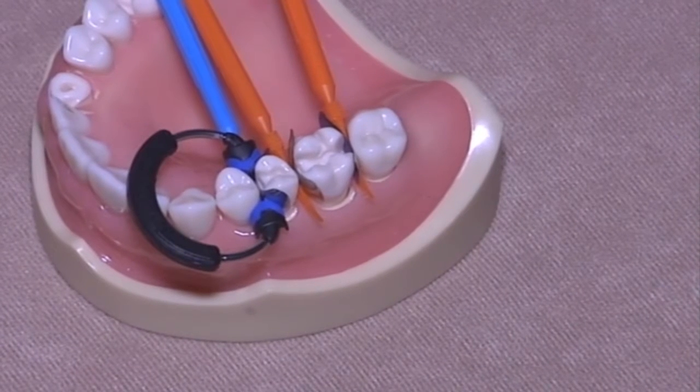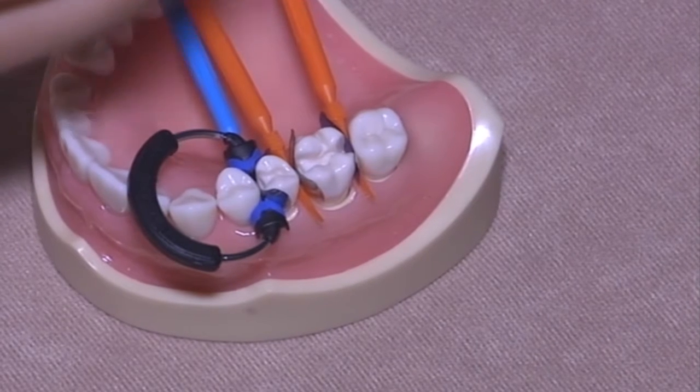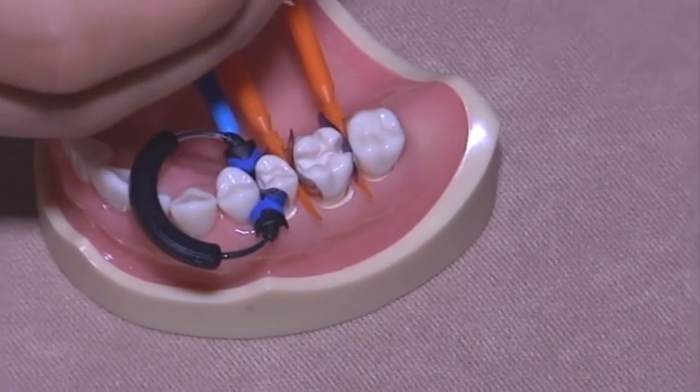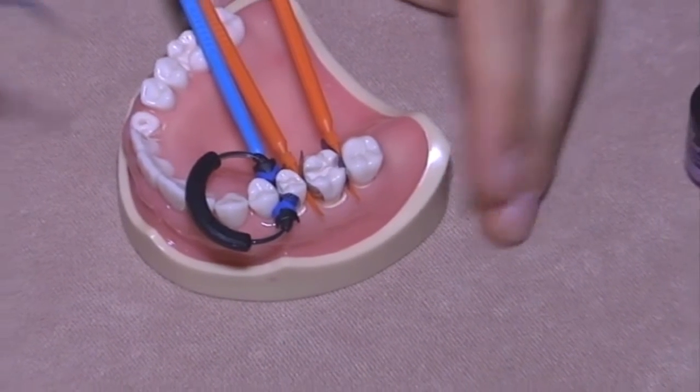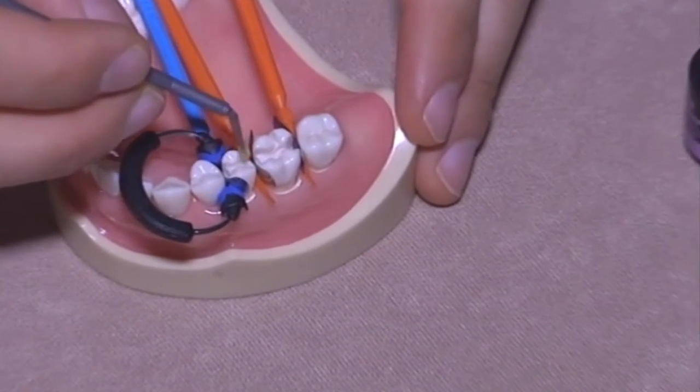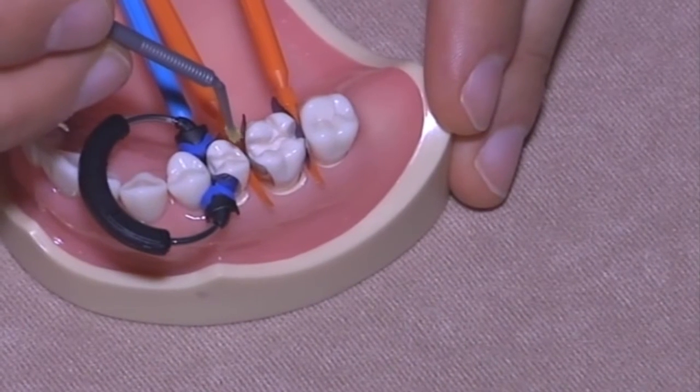So independently of the cavity you are beginning to fill, we can use bonding resin on both. Technically, in a real tooth, I would create a selective enamel etching.